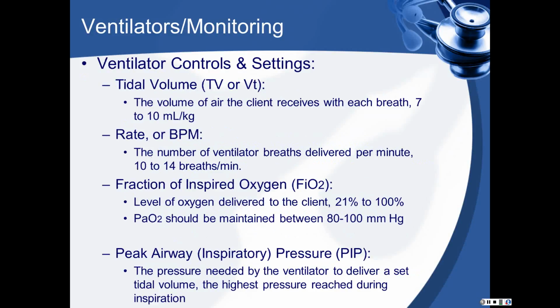The oxygen delivered to the client is warmed to body temp. It is also humidified to 100% because of that upper airway passage of the respiratory tree being bypassed. We do not want to cause mucosal damage, and that's what would happen if it wasn't warmed and humidified.